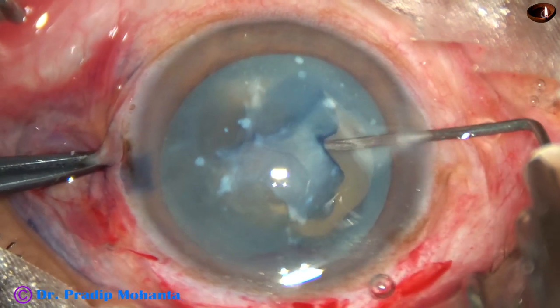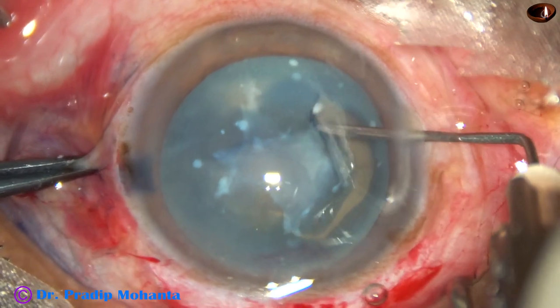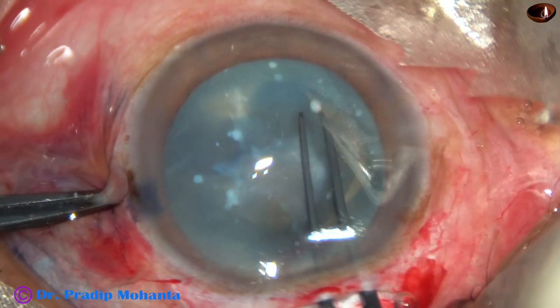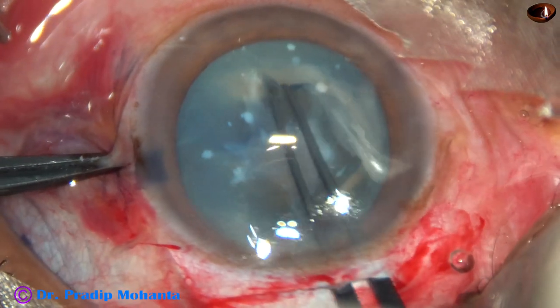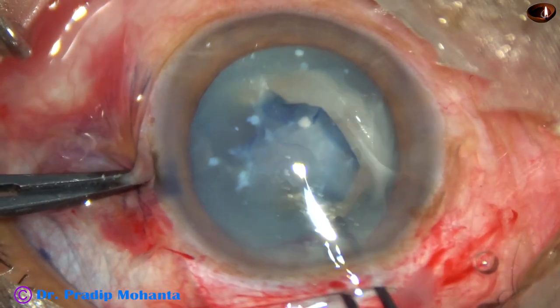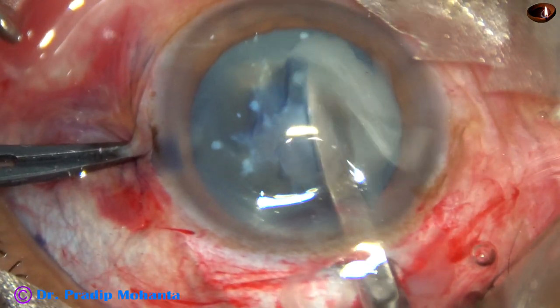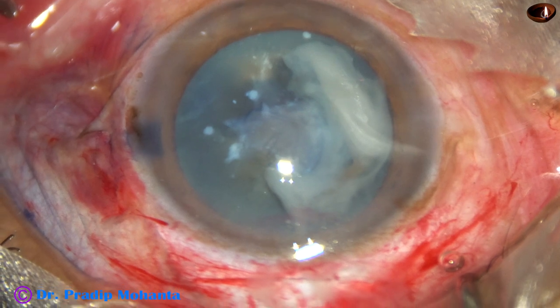Now I am going to use the Utrata again, because I cannot move the capsule with the needle anymore. I take the Utrata, hold the capsule, and as I go to 5:30 o'clock, I meet a thick fibrous band. If I pull the capsule, I feel great resistance. If I pull it vigorously, I am going to tear the zonule. So what to do now? I try to cut the band through the main incision, but it is very cumbersome. I could not do that.